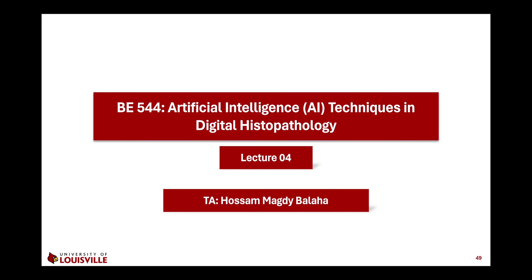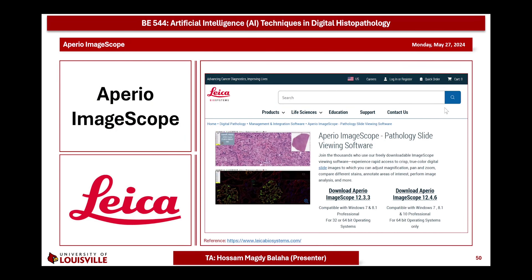Hello everyone, this is lecture 4 of BE544. In today's lecture we are going to deal with another software called ImageScope. ImageScope is a pathology slide viewing software, considered a free software that can be used to compare different things, annotate different areas of interest, and perform image analysis. It's easy to use and can be used for educational and research purposes.